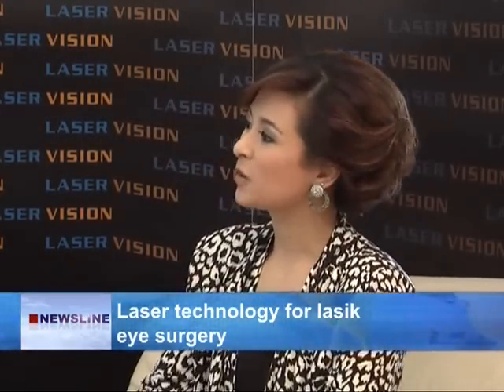Now, in terms of evaluating if a patient is a good candidate for LASIK surgery, just now you said if the patient does not have any eye problems, then they can go ahead with the surgery. Yes. Does it mean that people of all ages, including children and teenagers, can do that too, doctor? No. Because as we have talked about, LASIK is a permanent treatment.